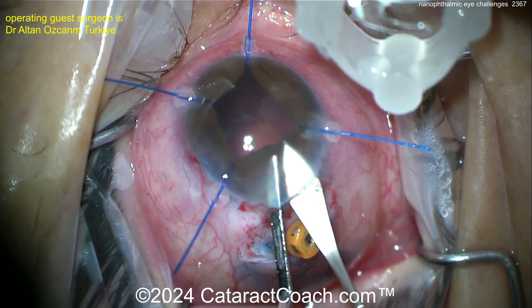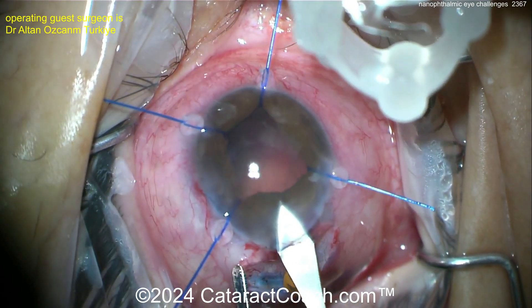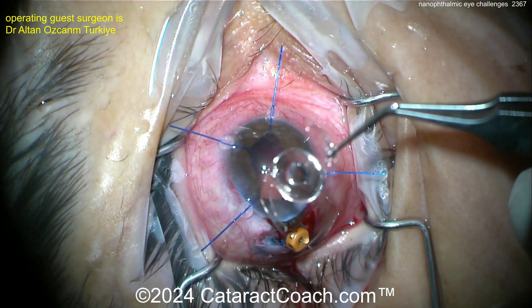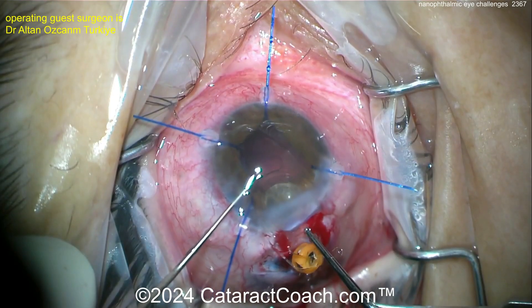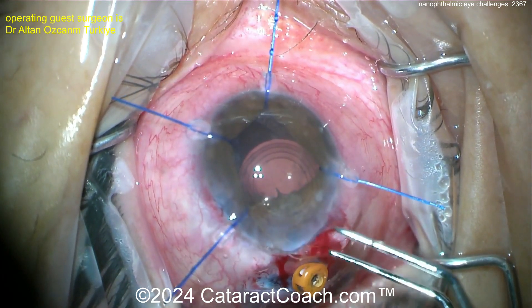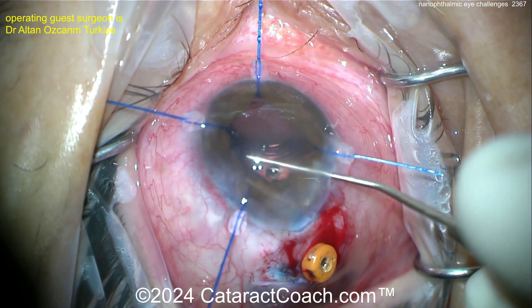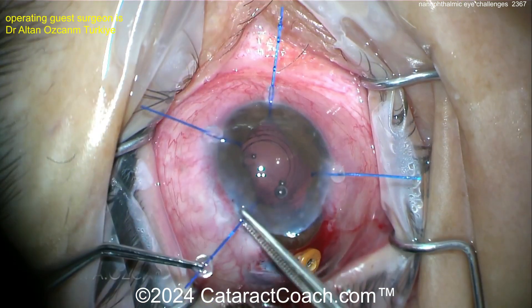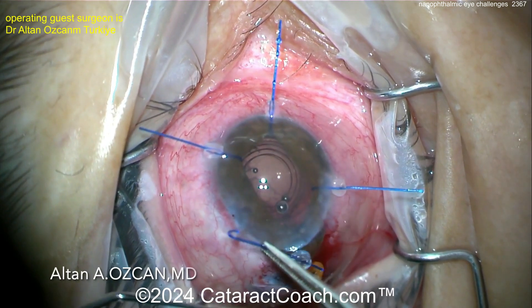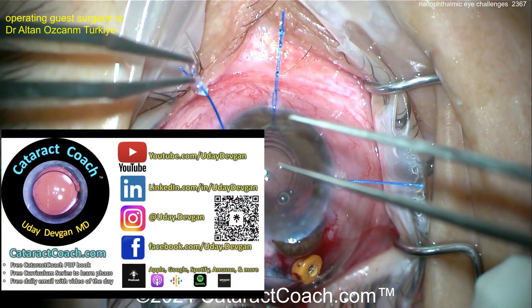This is a very high-power lens. In the USA the highest power available is 40 diopters; this one is 57.5 diopters. Look at the unusual lens design too. This lens could get damaged if placed through an injector — it's such a high power, it's so thick. So the surgeon is enlarging the incision and placing it in the eye manually. At the end, sutures are placed to seal that up. What a tough case.